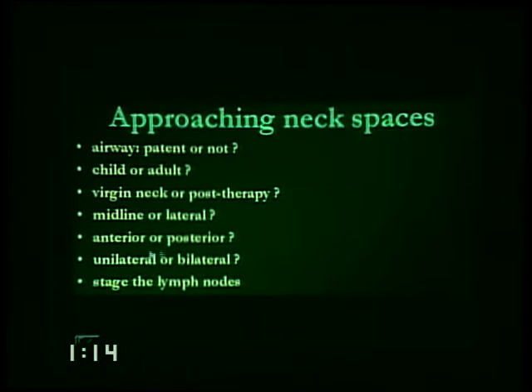Is the mass in the midline, or is it lateral? Is it anterior or posterior? And you're going to be able to stage the lymph nodes by looking for them. We're going to talk about the lymph nodes next.